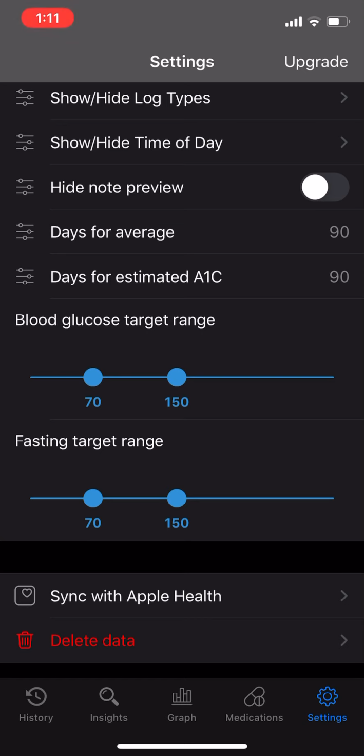So diabetes is definitely an issue that requires a lot of attentiveness on the patient's part. You have to check your blood sugar daily. You have to take different doses of insulin depending on the size of the meal you eat and other factors. So having an app to help keep patients on track with all of that, I think definitely has a good purpose. So I'll give it a 6 out of 10 for that.